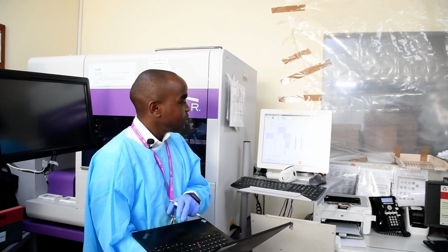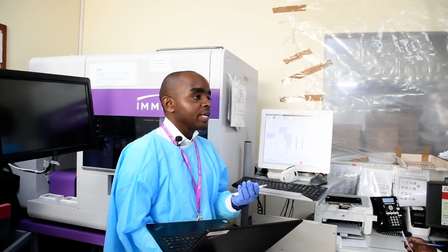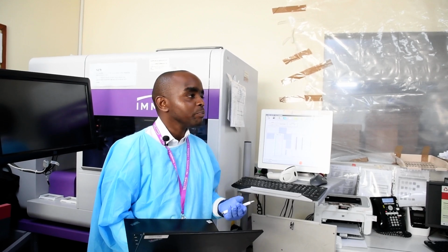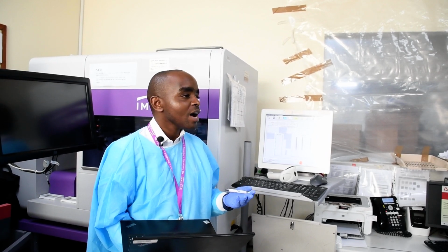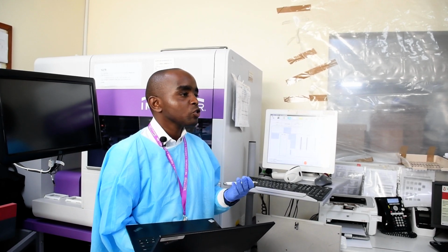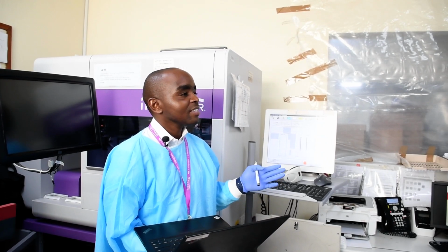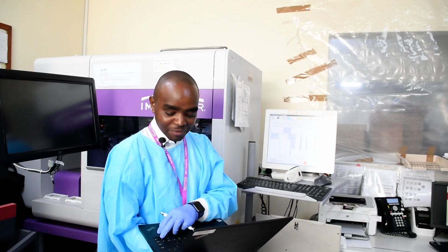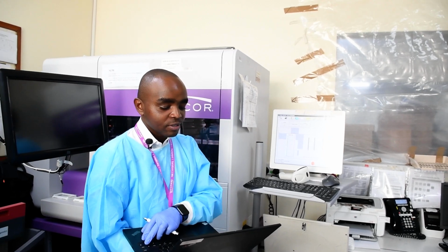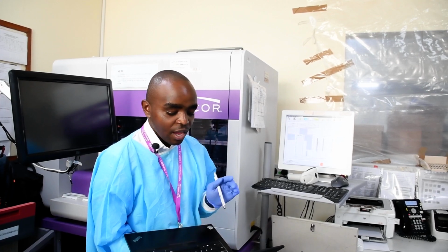So now, why do we do the titration, or why is it necessary for your platelets transfusion, when you are doing organ transplant, and for some countries, to prevent HDFN, the hemolytic disease of the fetus and newborn.